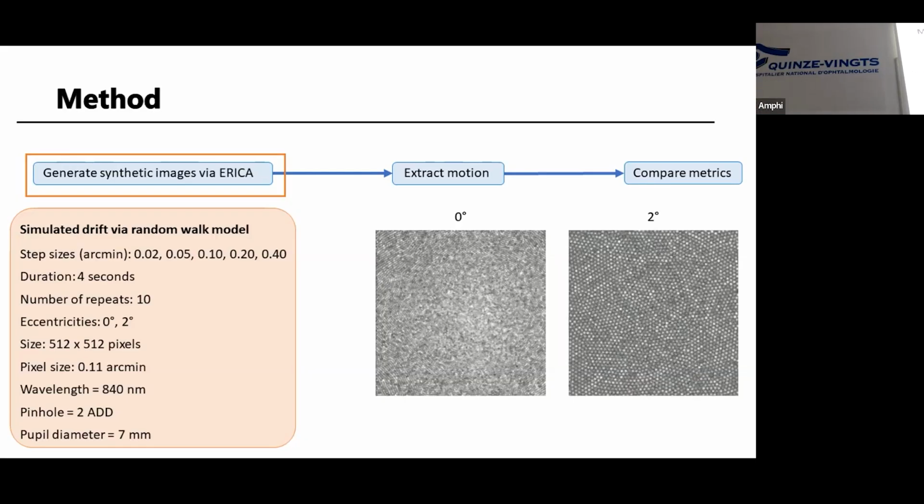Typically when we're doing our eye movement studies, we might not necessarily image at the point where we're presenting the stimulus if we don't want that AOSLO beam to be visible. Or you may be introducing your stimulus through the AO system, at which point you would direct the beam to the fovea. And what we've done is to introduce eye movements just for the drift component. I've done a separate study of microsaccades which have their own set of problems. So we've isolated out just the drift components.